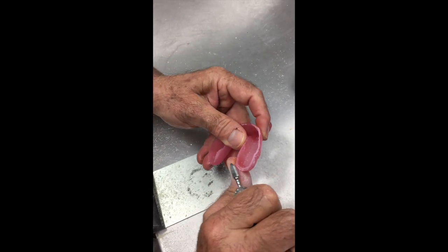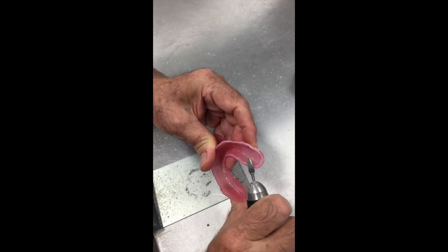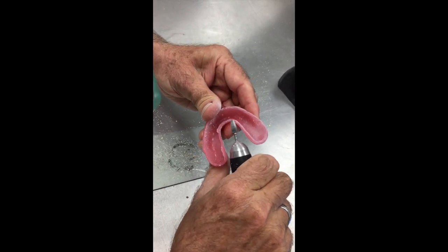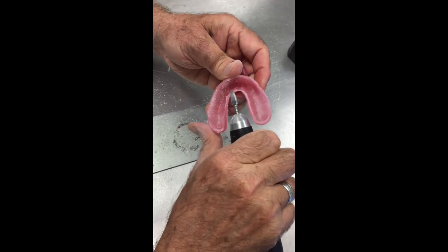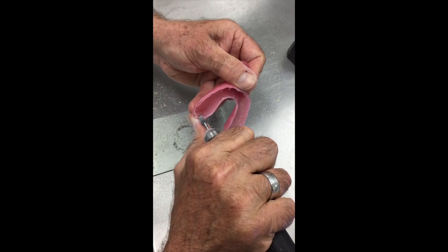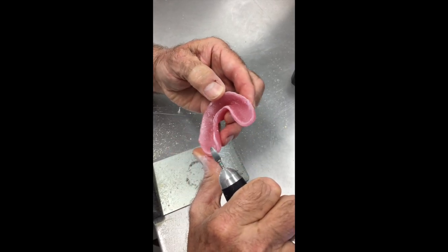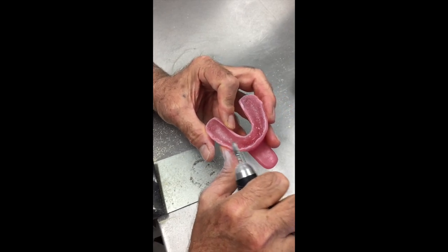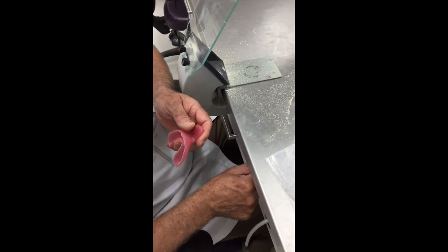I'm just making sure that this periphery is presenting with a nice, smooth, rounded edge, because this is going up into the mucobuccal fold area in lots of cases, and over soft tissue that's very sensitive, and sometimes very dry at the end of this procedure that the patient has been through, so it's nice to have this nicely smooth. We don't want to thin the periphery down at all, we're just taking off all of the sharp edges so we don't have it hurting the patient. Doing this, we try not to go up over the surface and change the colour of that material, because then you would have to make the tray a uniform colour. So now we have that nice smooth periphery.